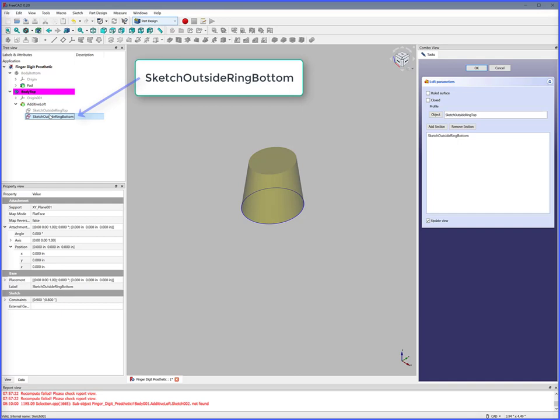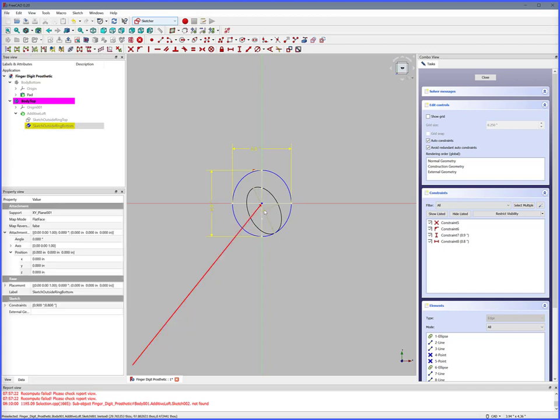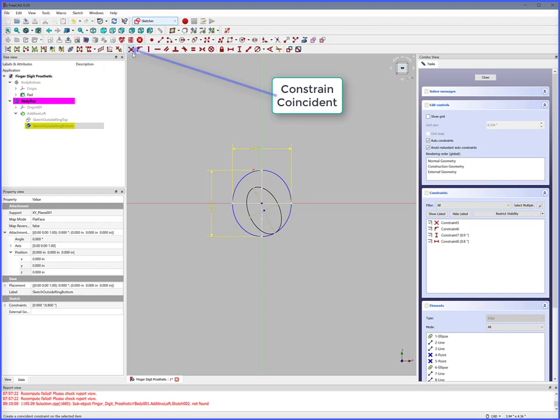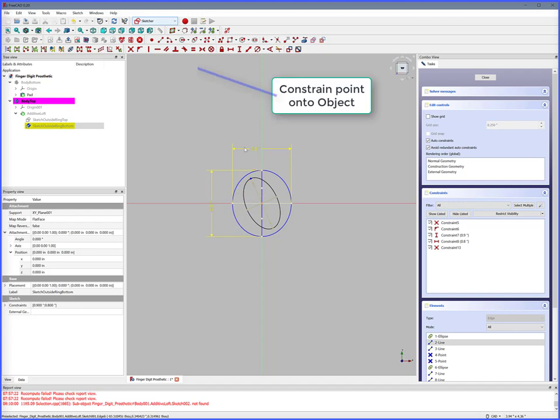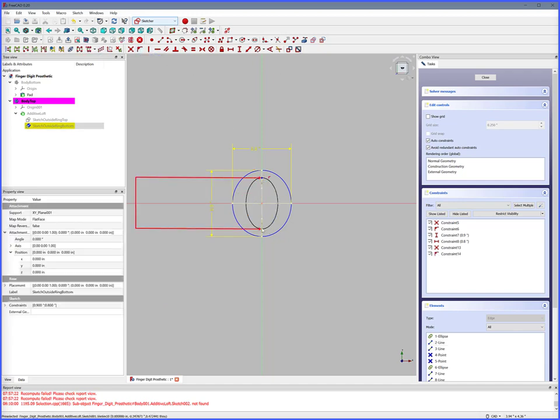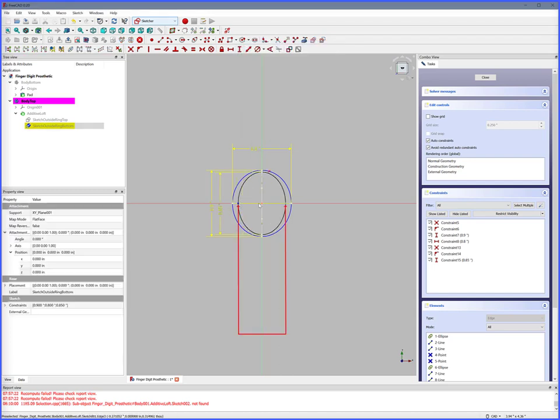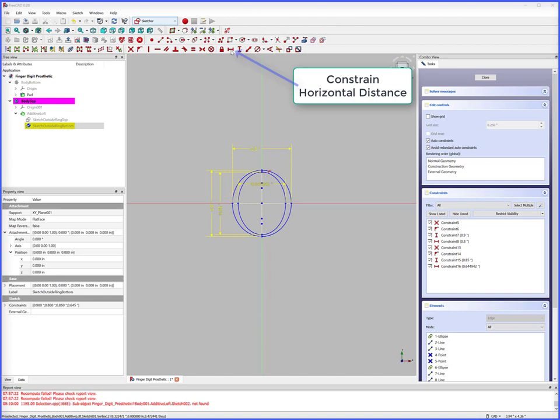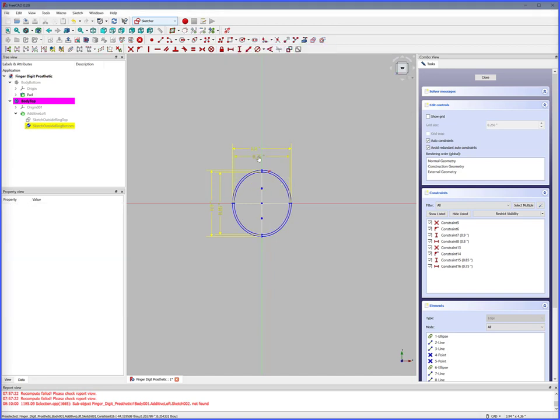Double click Sketch Outside Ring Bottom. Ellipse by center, click, double click to complete, right click to release. Select XY center, select center of ellipse, Constrain Coincident — now centered. Select ellipse point, select Y axis, Constrain Point Onto Object — now symmetrical. Select Y max points, Constrain Vertical Distance — cylinder inside Y diameter is 0.85 inches. Select X max points, Constrain Horizontal Distance — cylinder inside X diameter is 0.75 inches. Close.